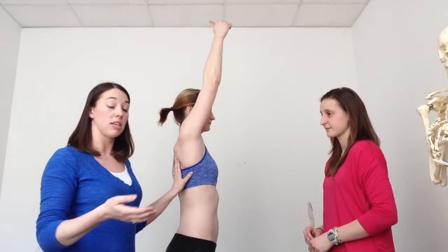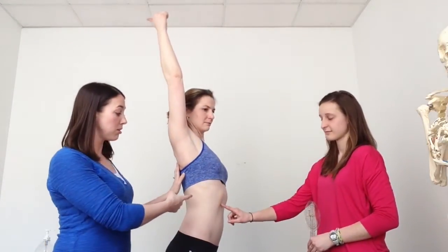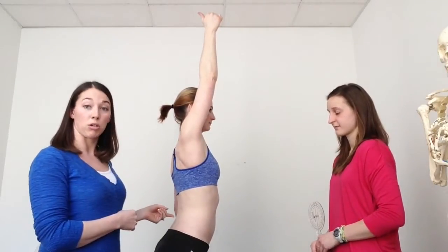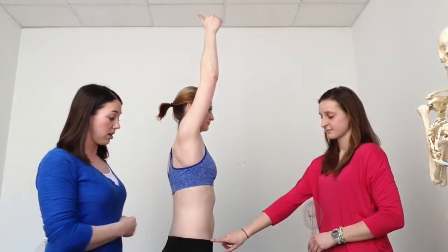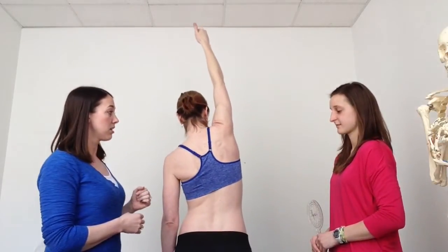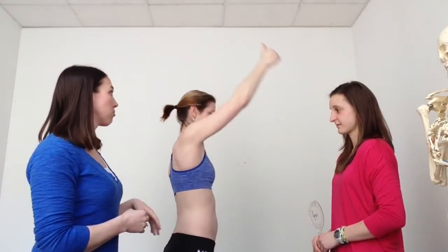Compensations that you might see would be ribs protruding anteriorly, an excessive amount of lumbar lordosis, an increased anterior pelvic tilt, or shoulder hiking. Good. Go ahead and bring that arm down.